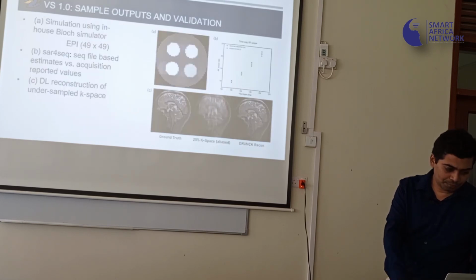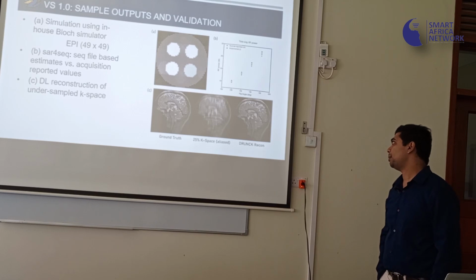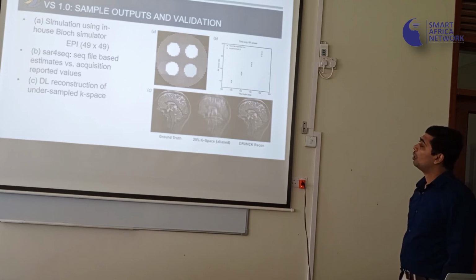Here are some sample outputs for evaluating one of the sequences called echo planar imaging, which actually won the Nobel Prize for Peter Mansfield and Paul Lauterbur.